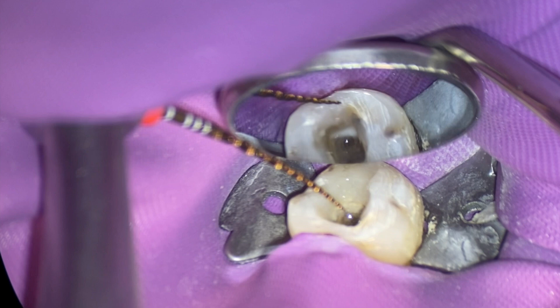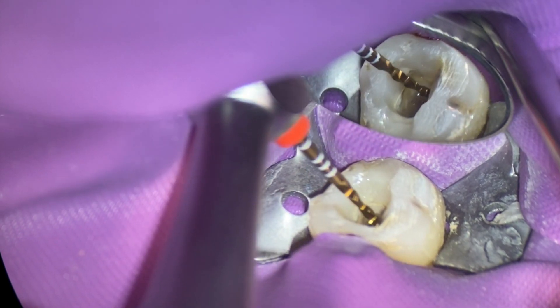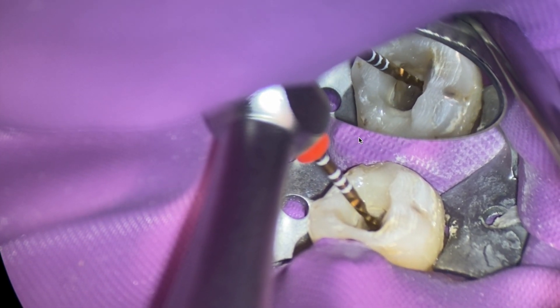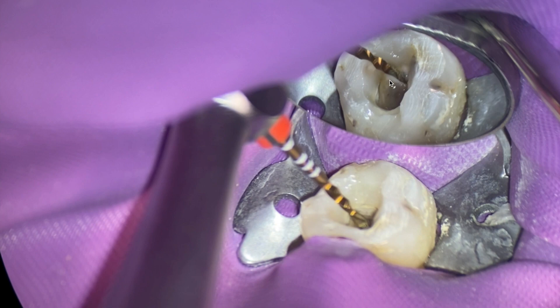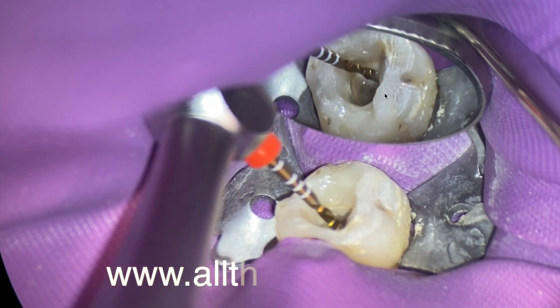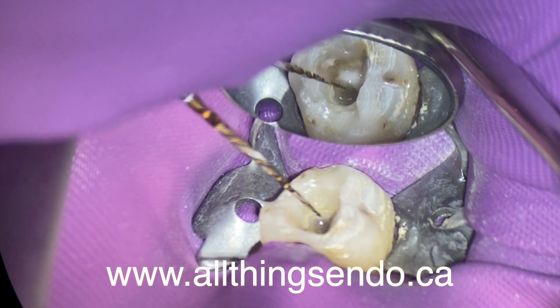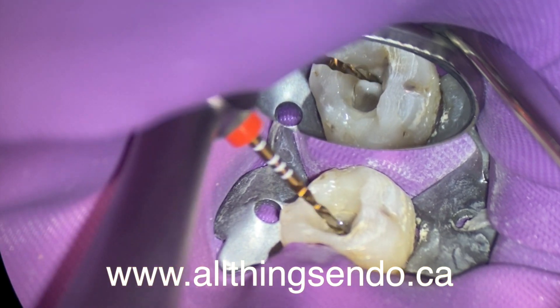You pull the file out and you're like: does that look like it's unwinding or doesn't it? Have an idea before, and if it looks like it's unwinding, go ahead and just replace it — replace that file because it's cheaper. It's cheaper to replace a file now than to try to get the file out if it fractures, especially if it may affect your outcome where there's a lesion of endodontic origin and it's one of your first files down the canal.